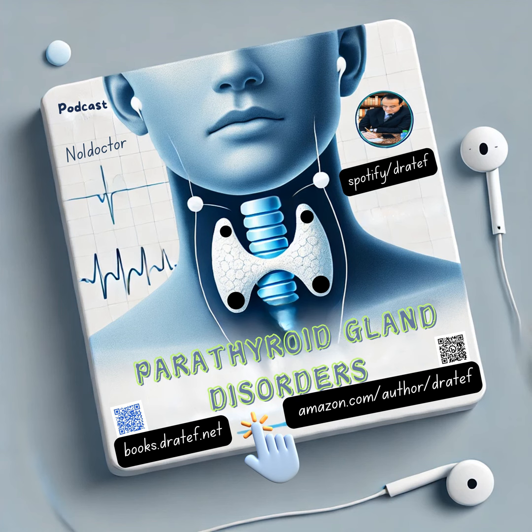You got it. Think teeny tiny incisions, sometimes even just a single keyhole opening. Wow, so no more big scar across the neck. Nope. Surgeons use specialized instruments and an endoscope, which is like a tiny camera. It gives them a magnified view of everything. It's like they're looking through a microscope right inside the body.